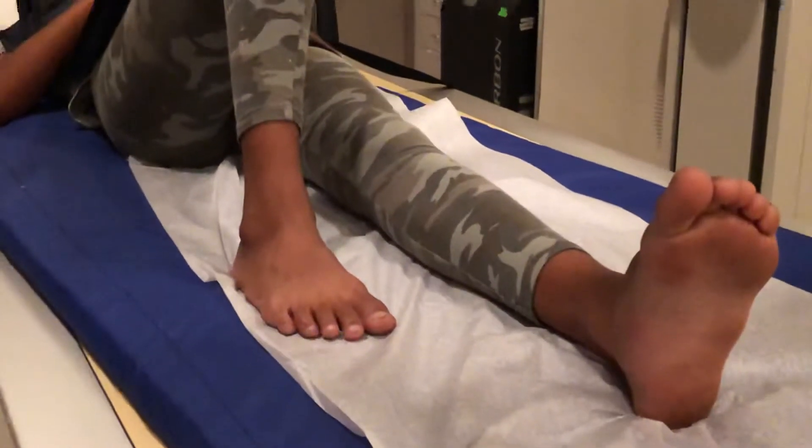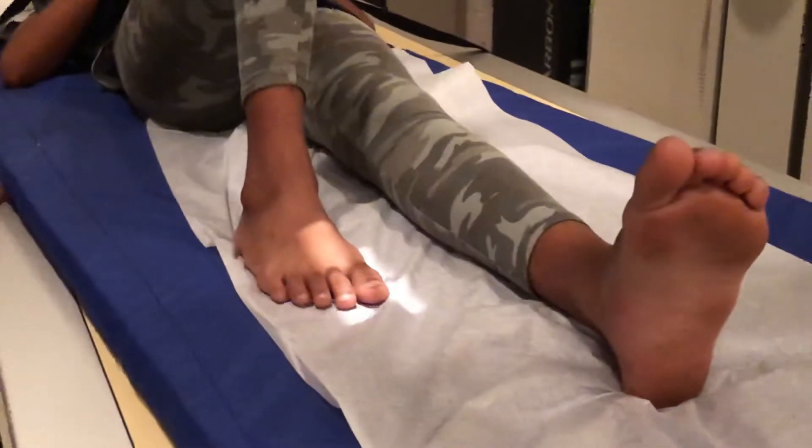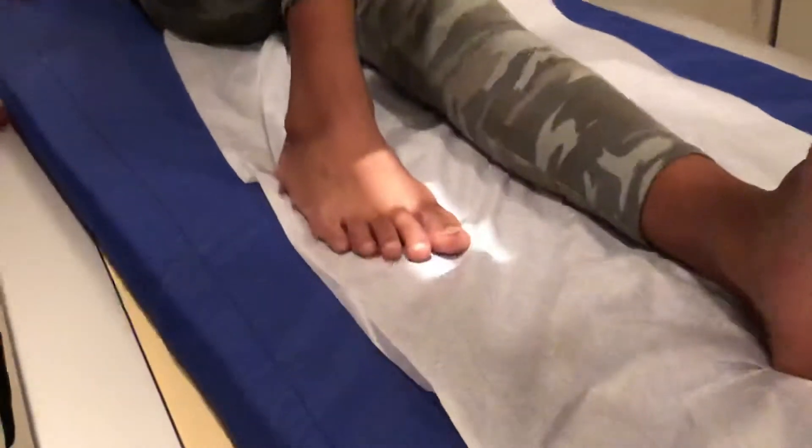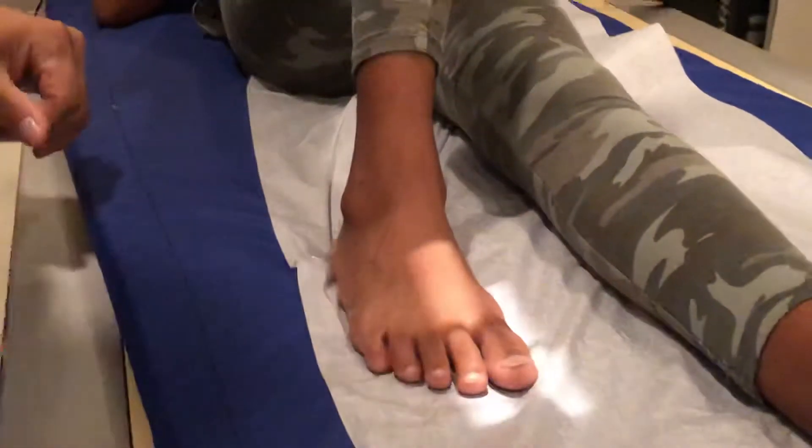The way it works is we're gonna center at the base of the big toe, right here. You can get closer if you want. Center at the base of the big toe, foot flat on the mattress, and that's the first one.